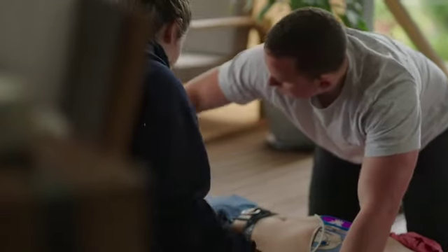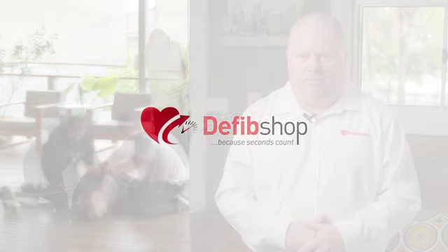If the patient wakes up or appears to wake up, roll them onto their side into the recovery position, and leave the defibrillator pads on there in case they go back into sudden cardiac arrest, in which case the defibrillator will pick that up. But otherwise, roll them on their side, comfort them, put a blanket over them if you have one, and wait for the paramedics to arrive.